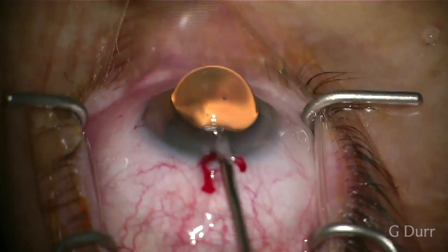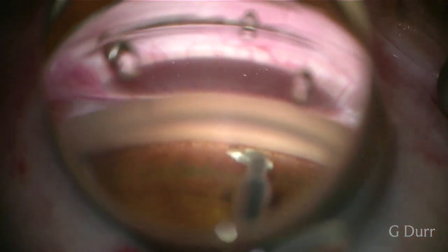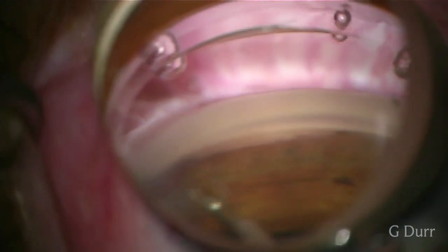We bring our gonio prism and we see here the Trabex, which is a trapezoidal design with serrated edges, with two different blades allowing to excise a strip of trabecular meshwork. This trapezoidal design as well as the serrated edges allows for a smooth entry of the device into the canal, and we really don't have to change the angle of approach when starting our trabeculotomy. We can simply oppose the Trabex on the trabecular meshwork and then slide it in the direction that we're going.